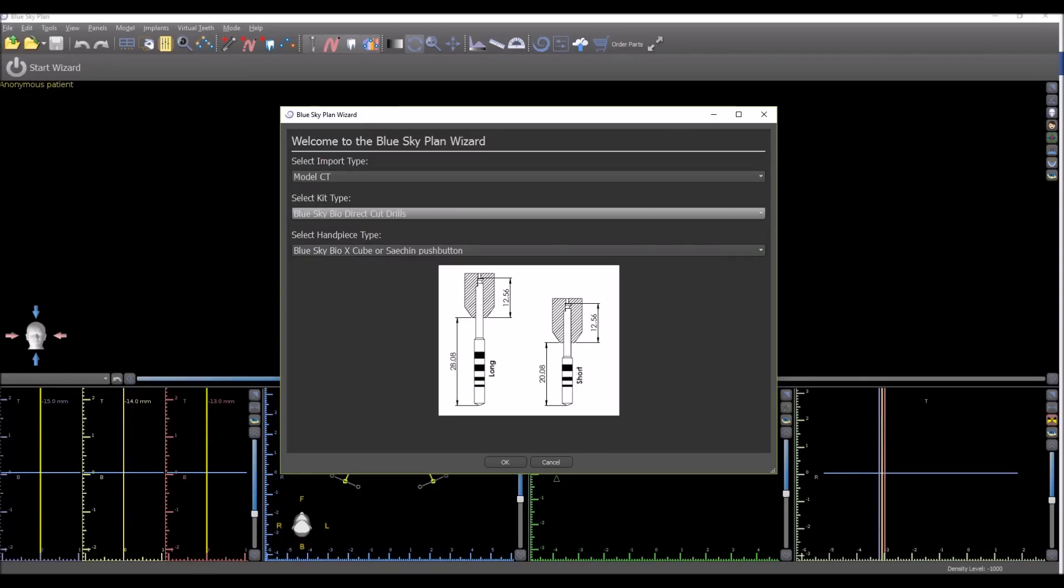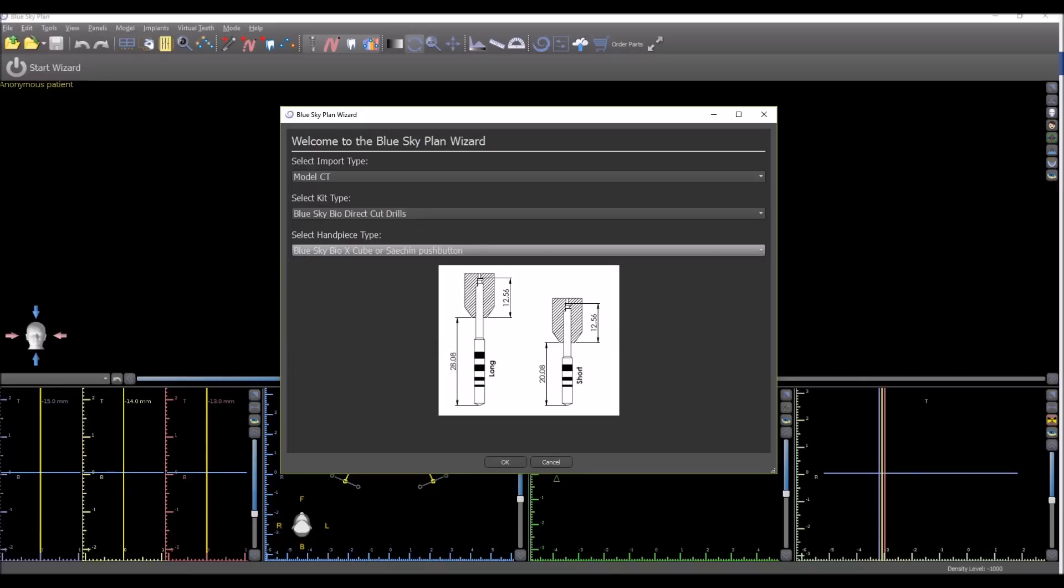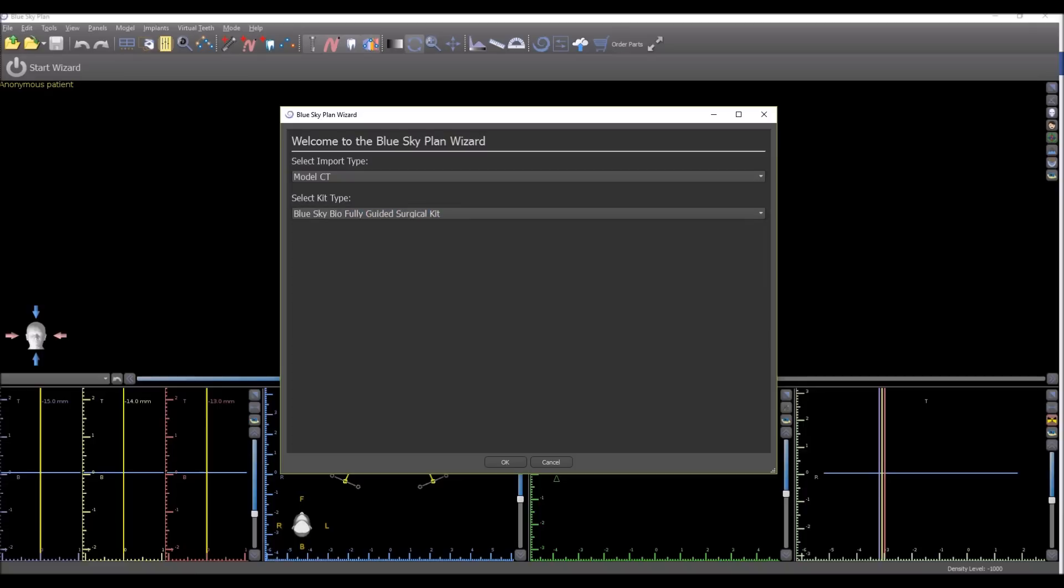And if you are using the direct cut drills, then we have the drop down menu that comes up asking which handpiece you're going to be using to ensure the depth control is controlled properly. If you're using another kit, the fully guided surgical kit, then that option disappears as it's not relevant.